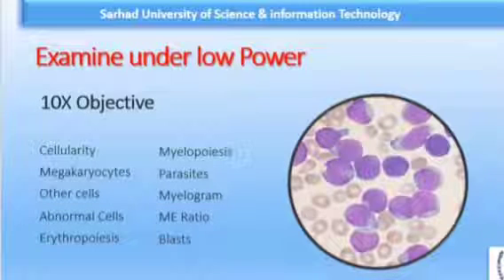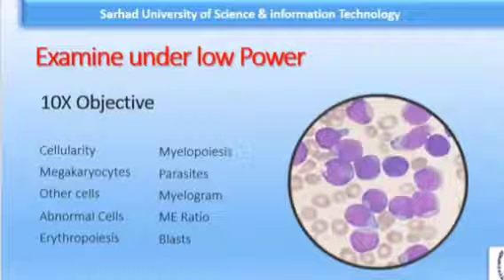Now examine under the microscope, and this is the most important thing.